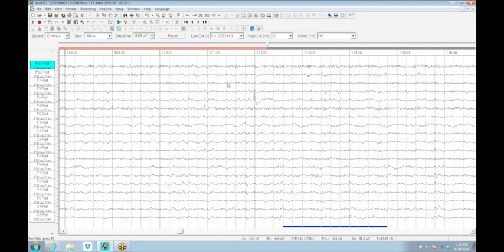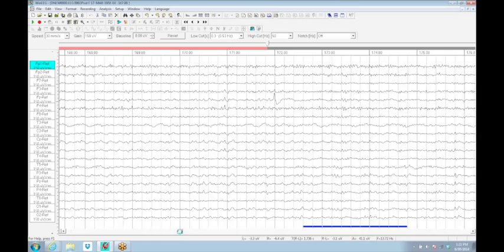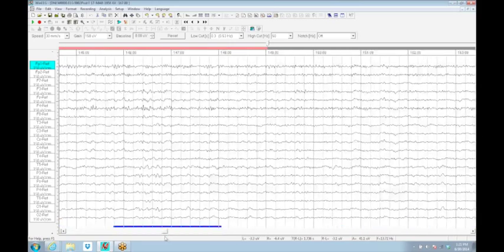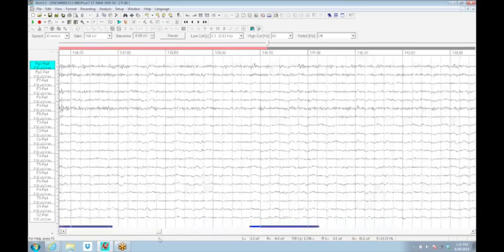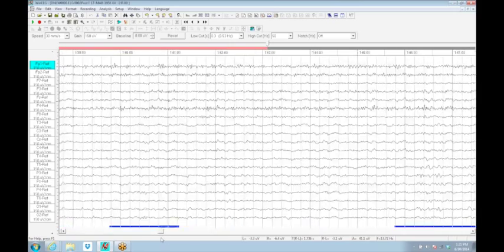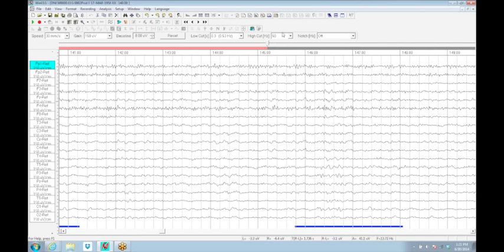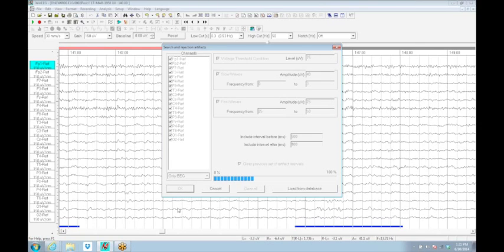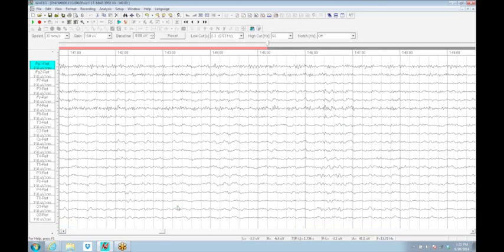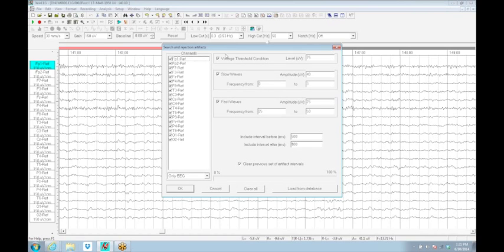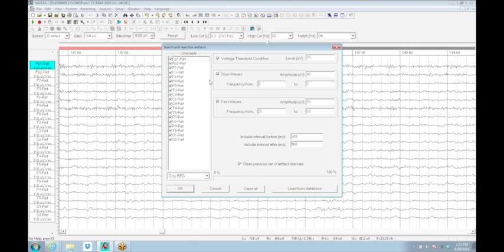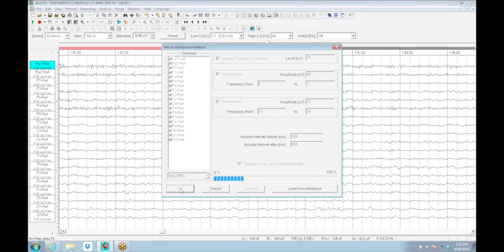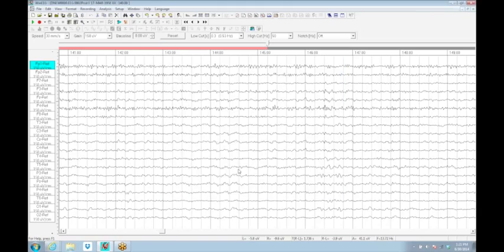Could you please show us how you eliminate that removal of the artifact, essentially taking away the blue line? All of those blue lines. We now go back up to here, and we can either rerun this, which will keep the bad pieces that still meet that definition, but it eliminates, when you have this window open, here's a clear previous set of artifact intervals. If that's checked, the artifacts are now gone. Those intervals will now be cleared. So running it again with that checked, this now only catches the big bad pieces that we wanted to get rid of.